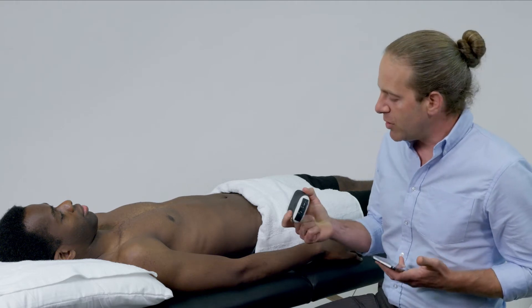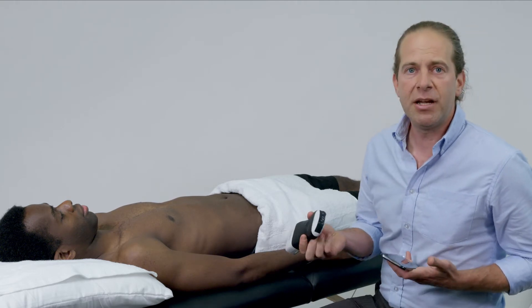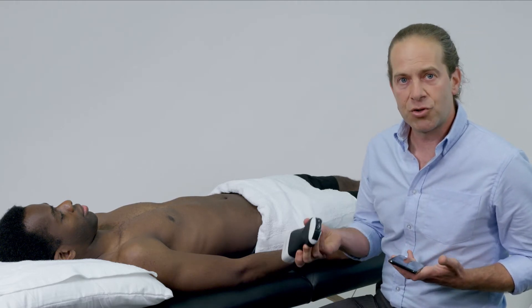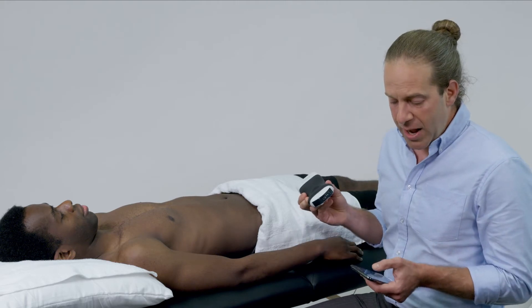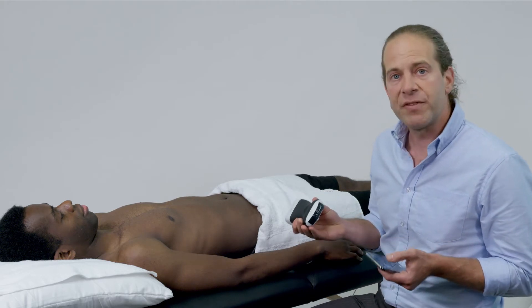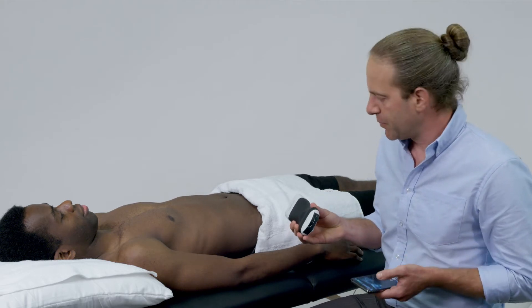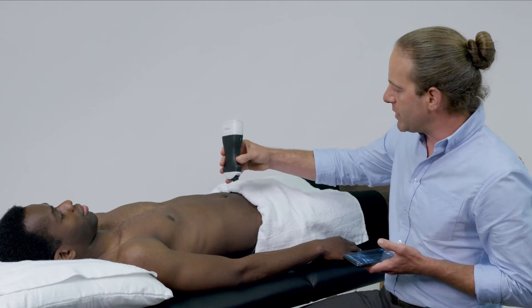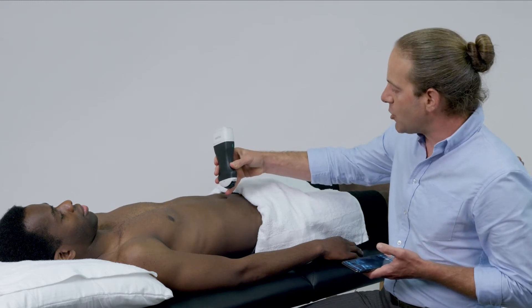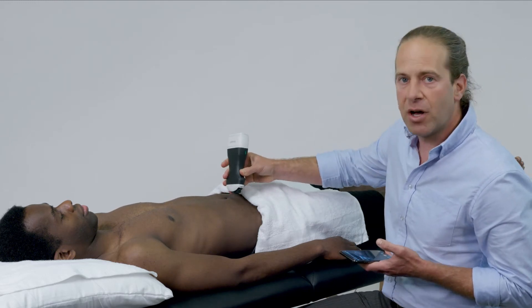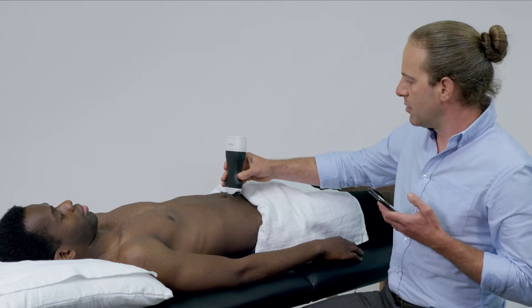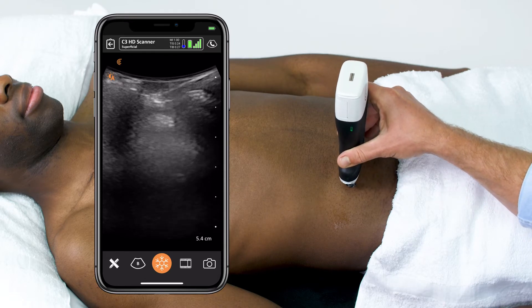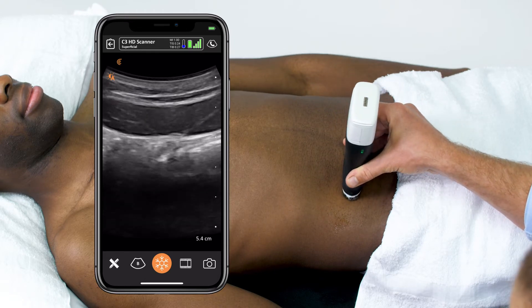To do this scan, you need a high quality curvilinear transducer. Here I am on superficial preset, and I'm going to take the indicator towards the patient's right side, and I'm going to start at the level of the patient's umbilicus in a transverse orientation with the indicator to the patient's right.